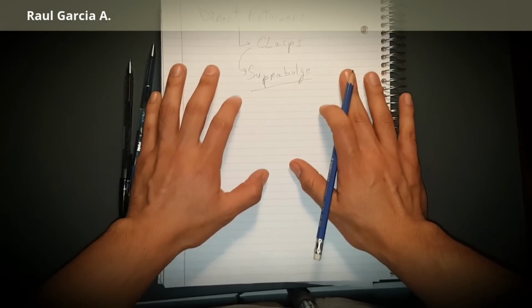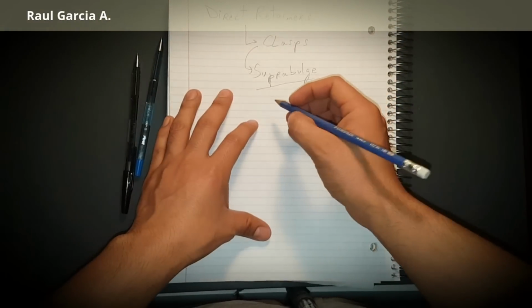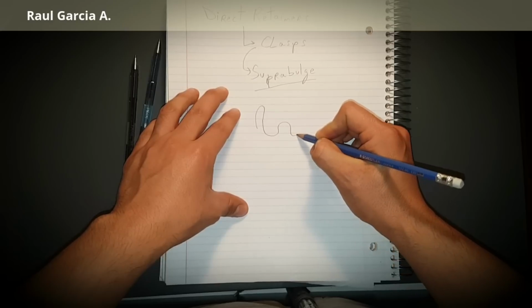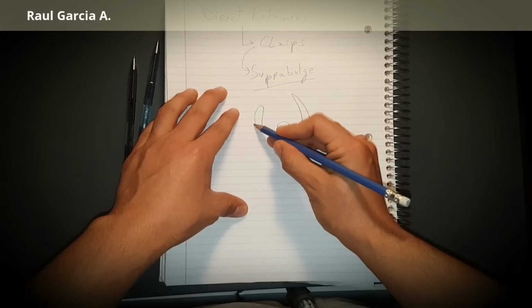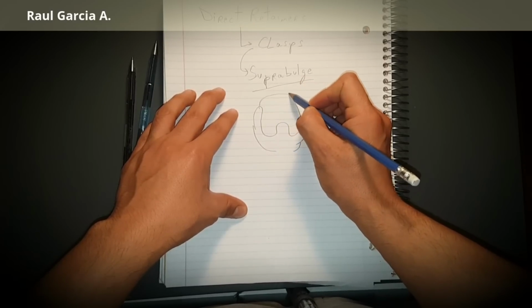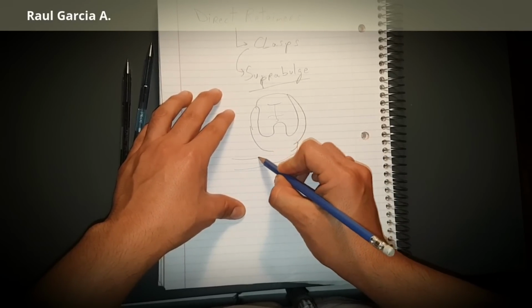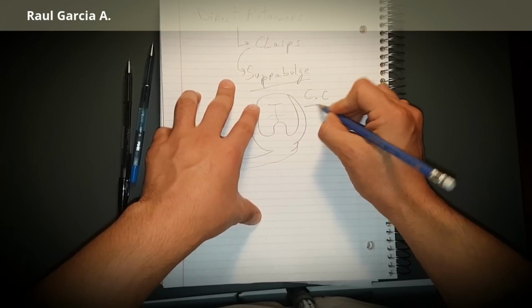So the first thing I want you guys to understand is the simplest one and the common shape that we have. It is like this. Just draw it like this. There we go. So imagine this is a molar, or a premolar, whichever. So we come like this. This is a regular cast circumferential.